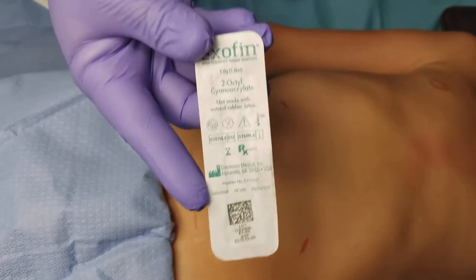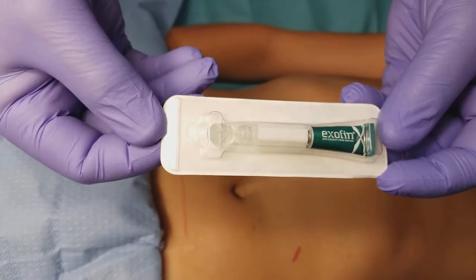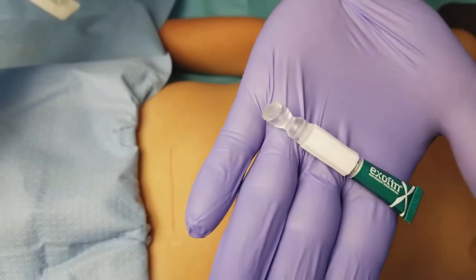This is an instructional video on how to properly apply Exofin tissue adhesive. This is showing the new blister pack — all you have to do is simply open the pack up and dump it on the table where it's already ready to use.